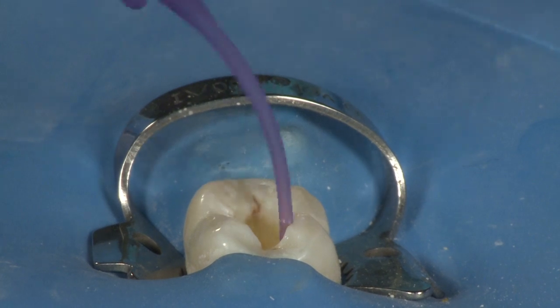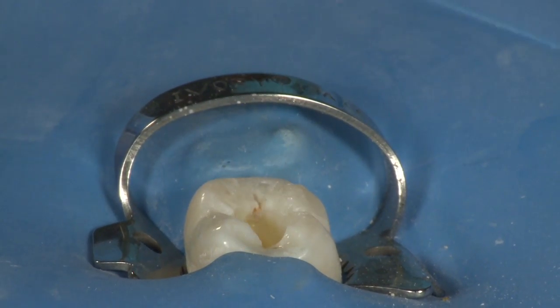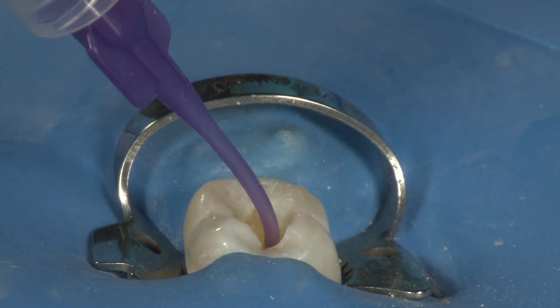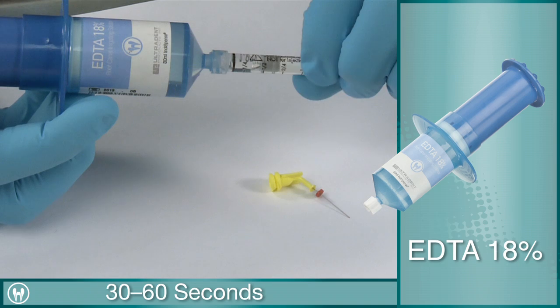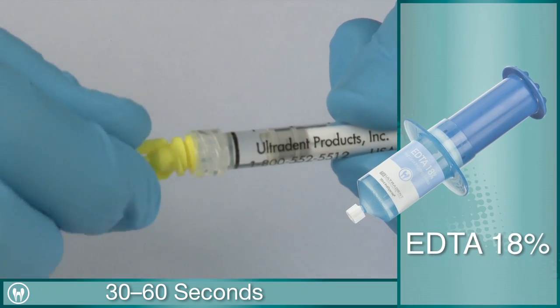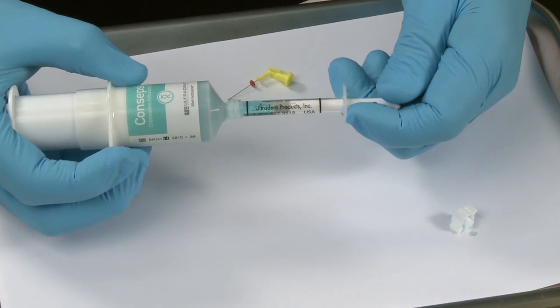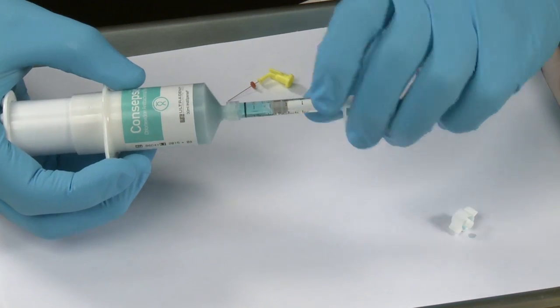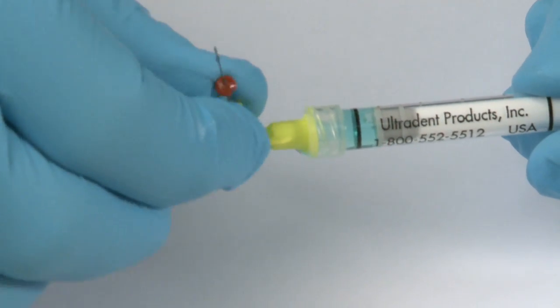Now that the instrumentation is finished, a final irrigation procedure will complete the cleaning and preparation of the canal for obturation. Load a 1.2-milliliter syringe with liquid EDTA 18% from the Indispense syringe and attach a 30-gauge Navi tip. Next, load a 1.2-milliliter syringe with Consepsis 2% chlorhexidine gluconate, and attach a 30-gauge Navi tip.